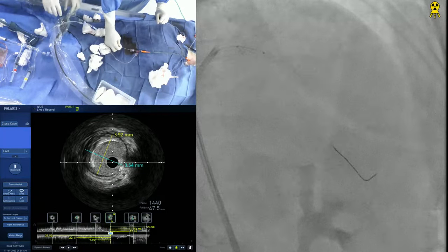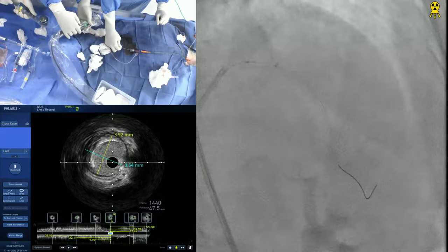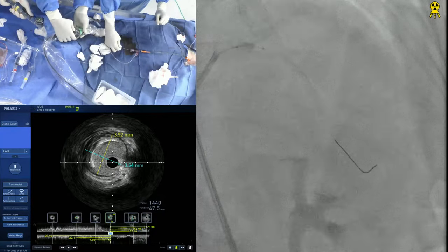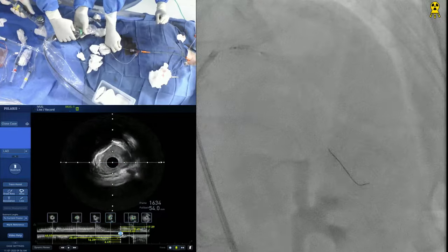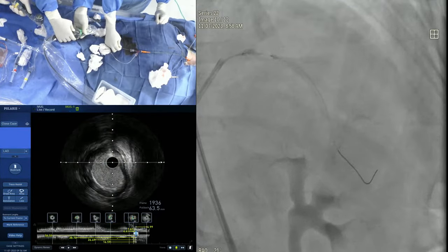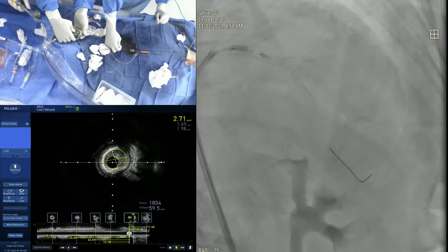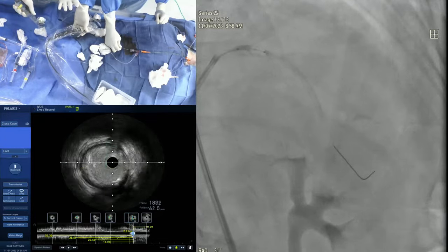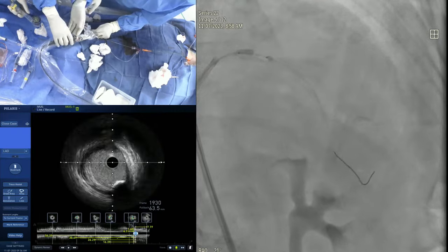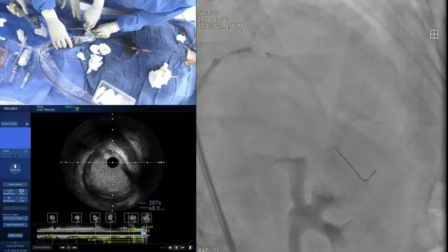Yeah, here, go up. Go. Four. Why is it not? A lot of air? Who prepped it? Okay, six, and go negative. Yeah, it will take a little time, it will come up. It will be okay. Yeah, that's air. But that's okay, go now. You have to make sure that the balloon has a dog bone or some effect.